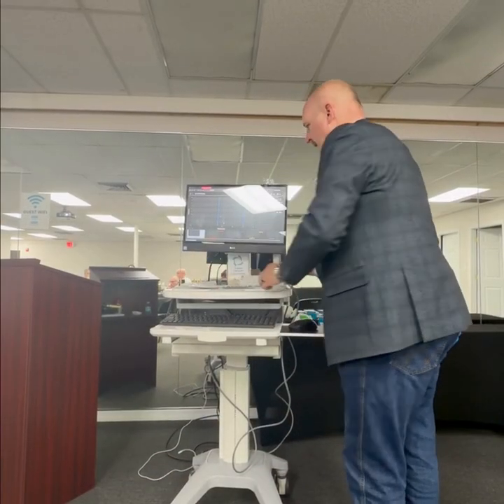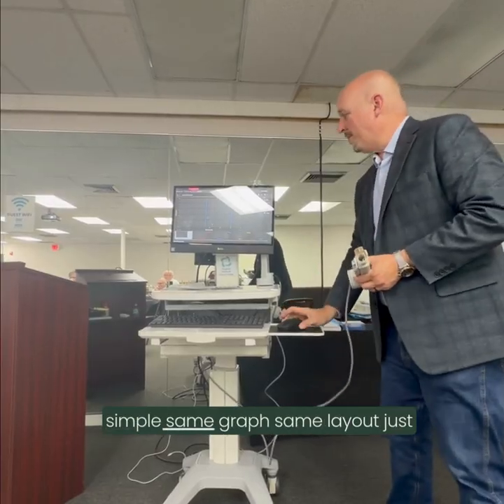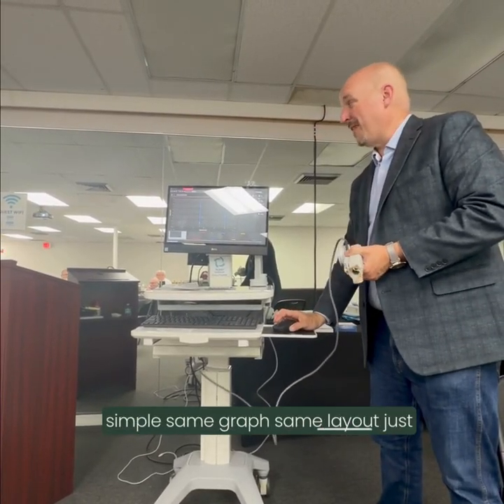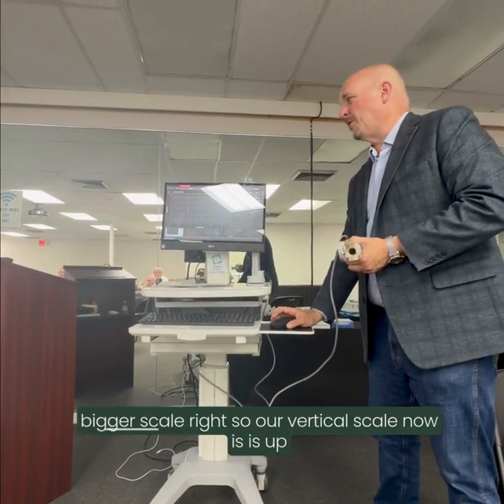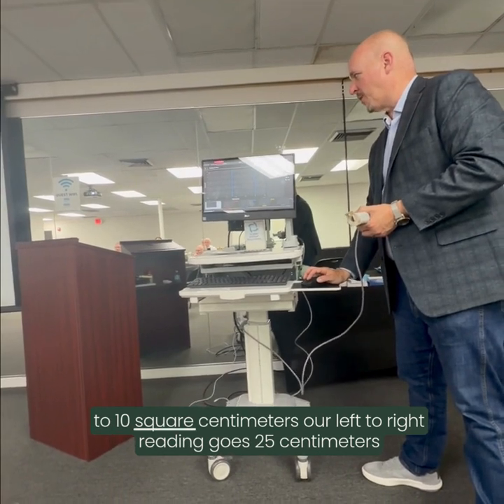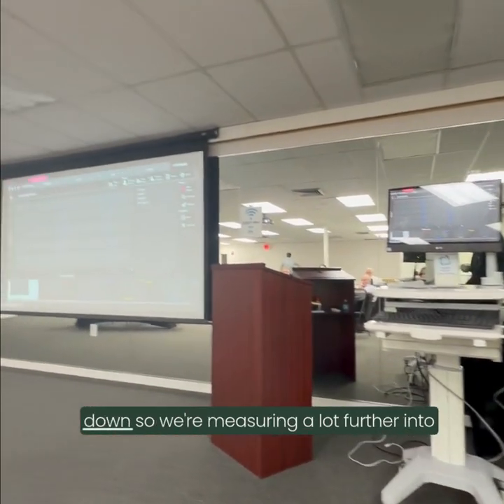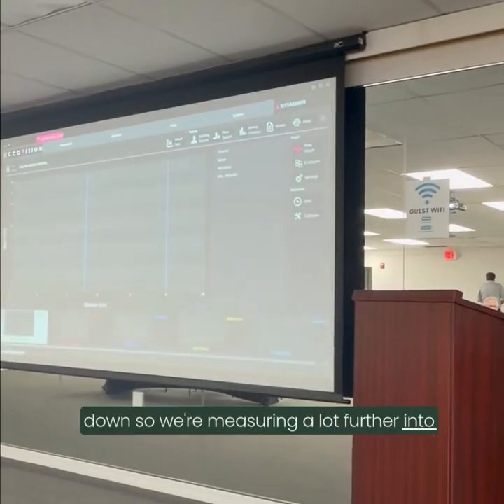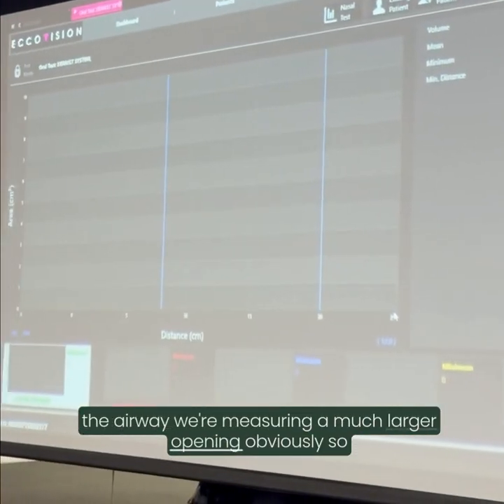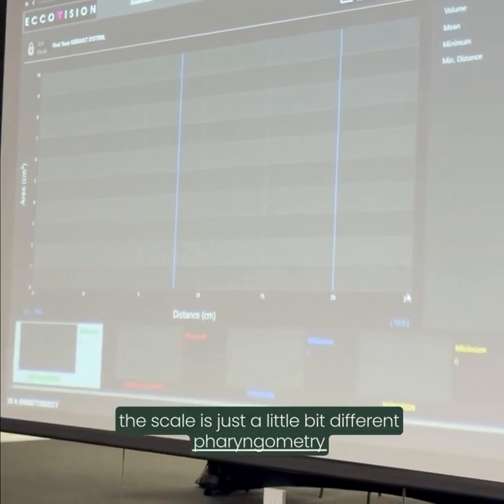Okay. So pharyngometry, real simple, same graph, same layout, just bigger scale, right? Our vertical scale now is up to 10 square centimeters. Our left to right reading goes 25 centimeters down. So we're measuring a lot further into the airway, a much larger opening, obviously. So the scale is just a little bit different.